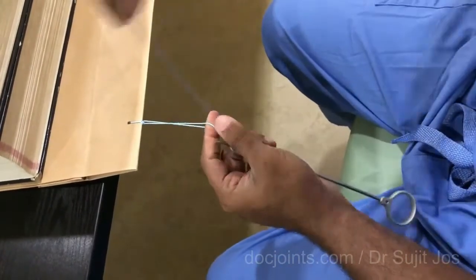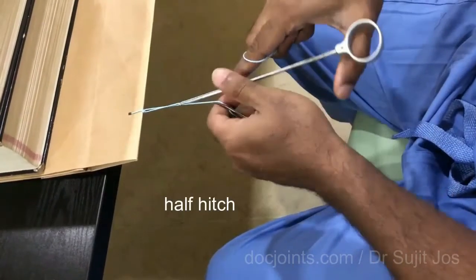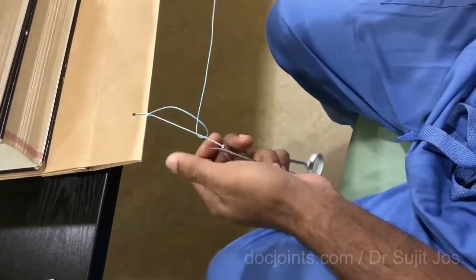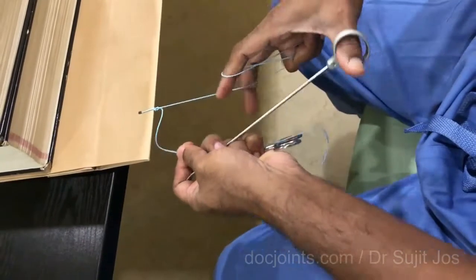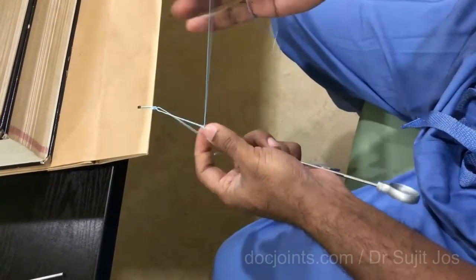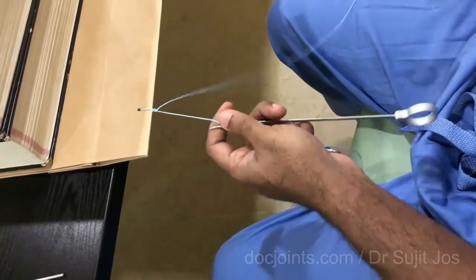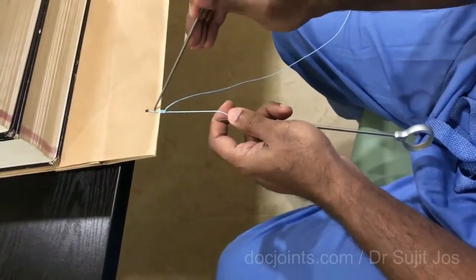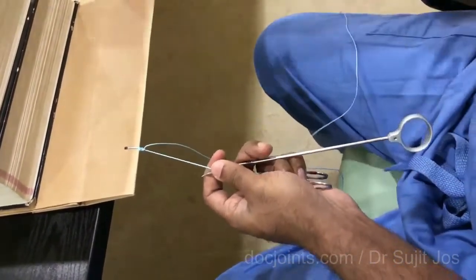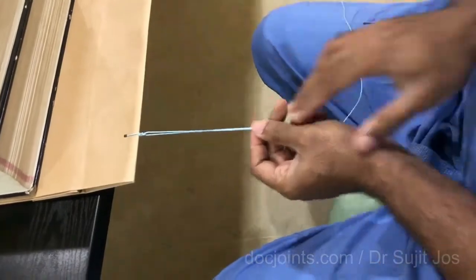Now you can use the half hitches — one on the right, use a knot pusher to tighten it, one on the left, one on the right, and one to the right again. It is basically the half hitches which hold the knot in position. Even if the knot is non-locking or locking, it doesn't make a difference. You can check the strength of the knot with your probe. Remove that, and the knots can be cut off with a knot cutter.